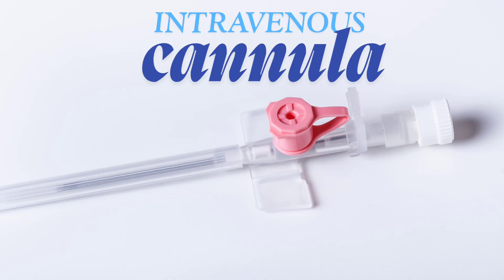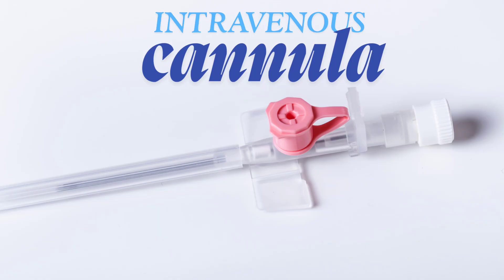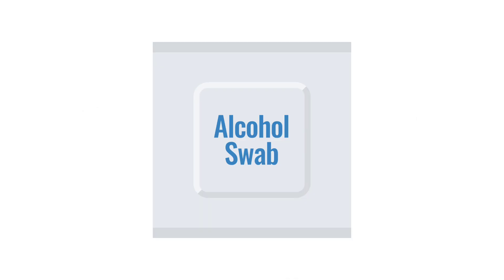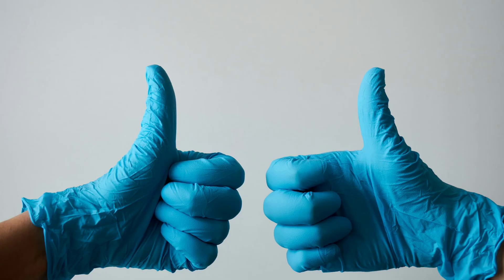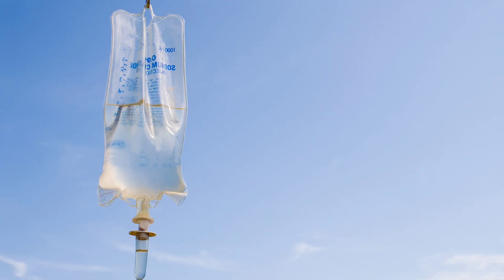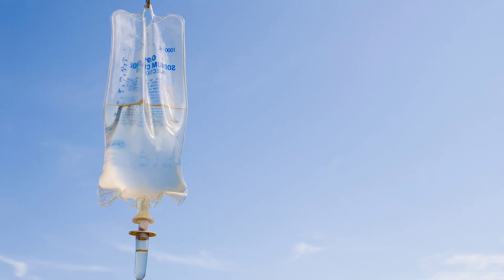Equipment you will need: 1) IV cannula, 2) tourniquet, 3) alcohol swab, 4) sterile gloves, 5) tape or Tegaderm to secure, 6) optional IV fluids, and 7) a sharps container to dispose of sharps.